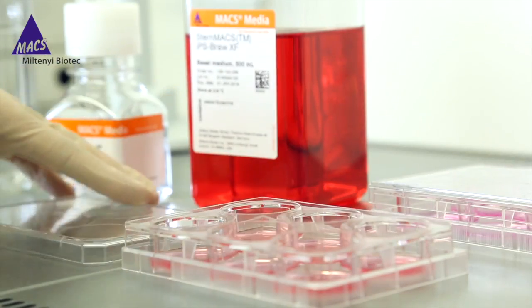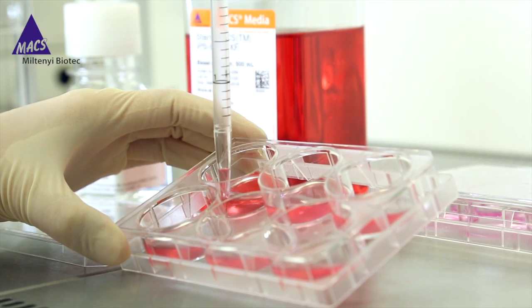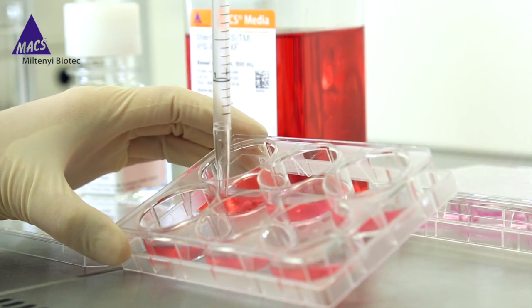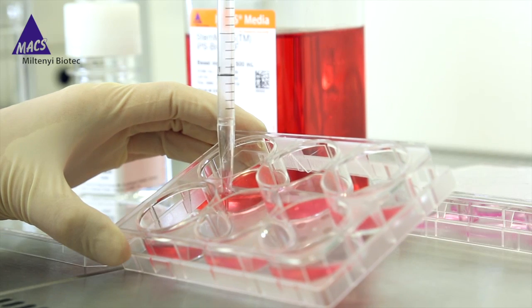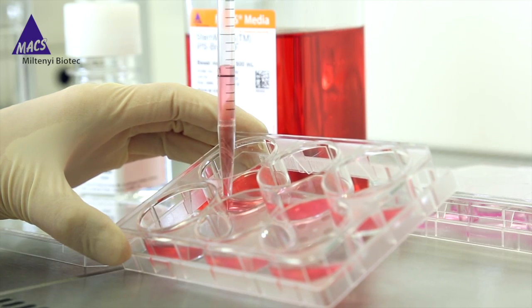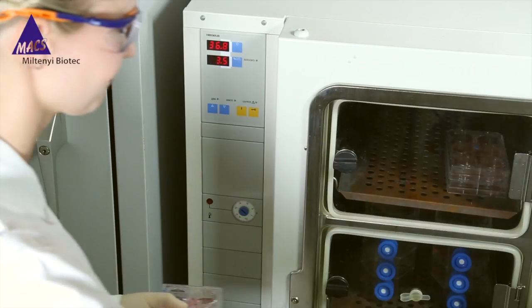Then the colonies are dissociated by gentle pipetting up and down. The resulting clusters are distributed into new pre-coated cell culture plates in StemMax IPSBrew XF supplemented with rock inhibitor. This procedure poses minimal stress to the cells and less hands-on time than the other methods.